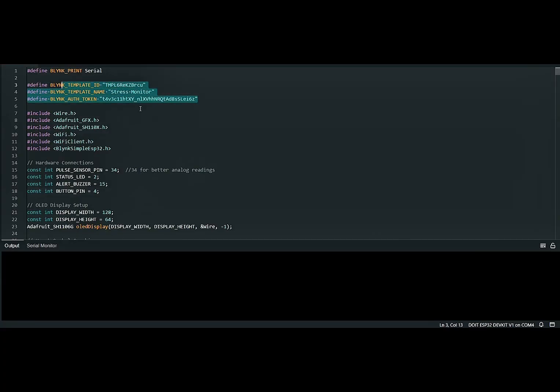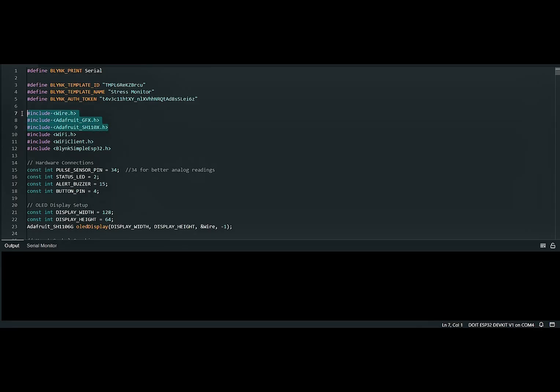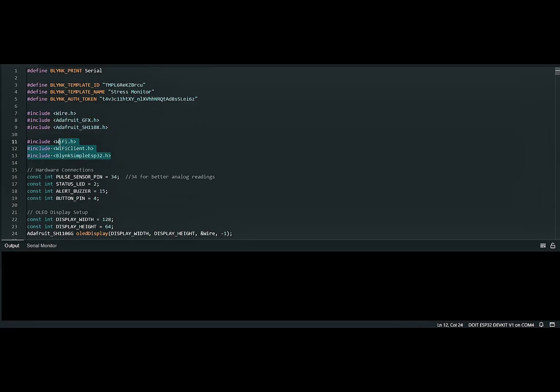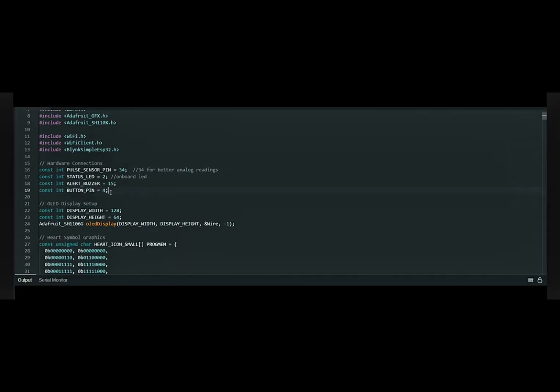Next part is the coding part. The first section is from Blynk. We will define the Blynk print, the serial, and the 3 lines that we copy from Blynk. Next is the library for the OLED. Next is the library for Blynk. Next is the hardware connection pin, the pulse sensor. So we use pin 34. Next is the status LED, pin 2, the onboard LED. For the buzzer pin, we use pin 15, and the button pin we use is pin 4.